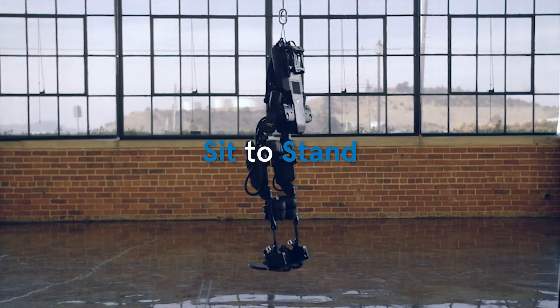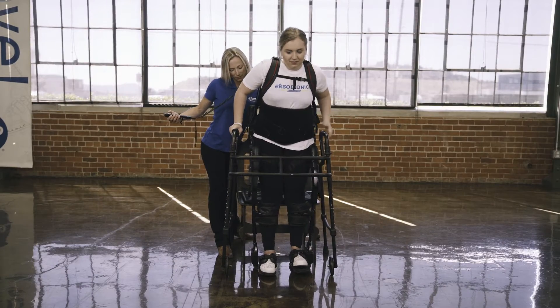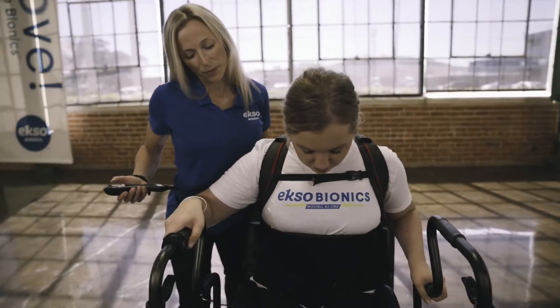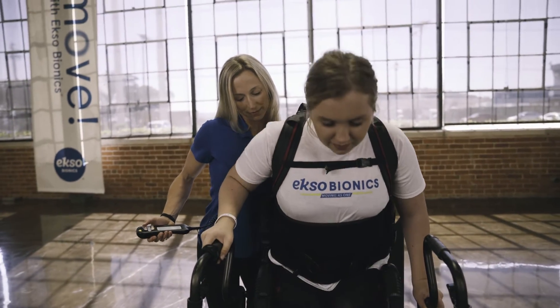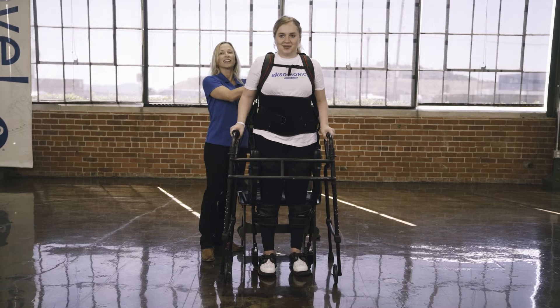The sit to stand is fully powered by EXO, but requires patient interaction to be ideal. The EXO will sit the patient up to 90 degrees and then lean forward. At the end of the lean, the patient must push up on the assistive device and assist with getting their weight balanced over their feet. The transition is assisted by the PT for balance purposes.